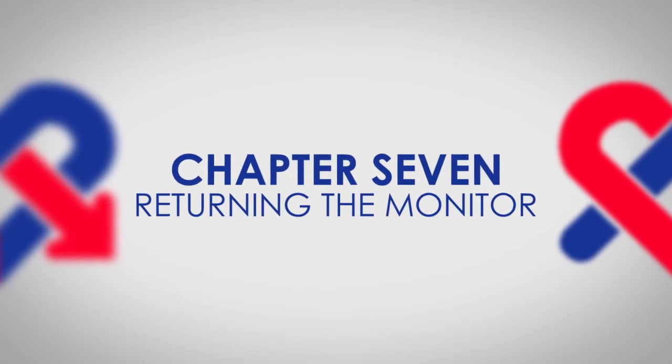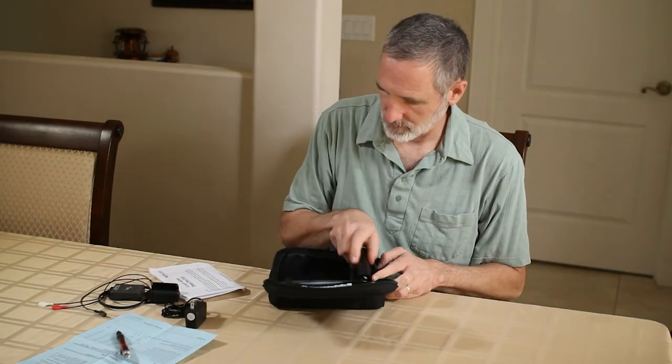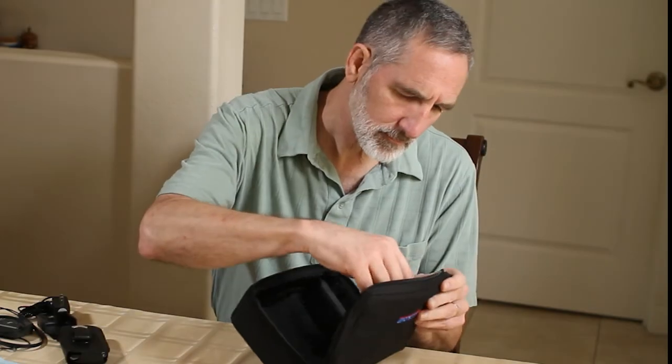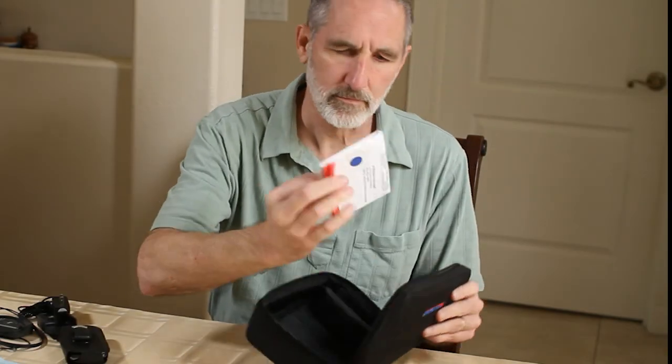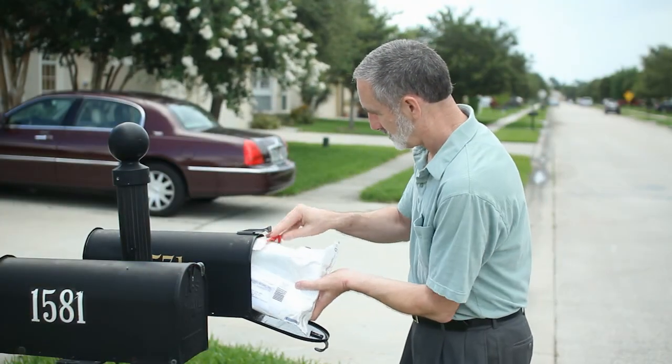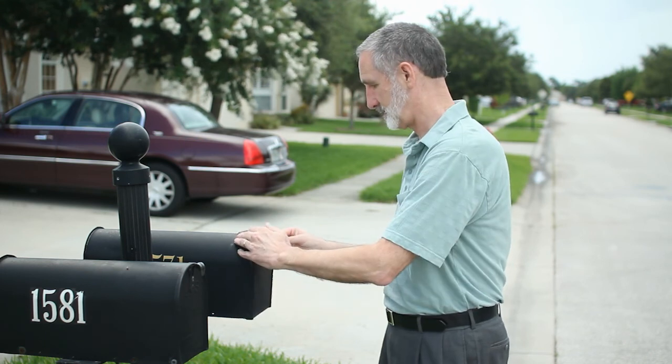Returning the monitor. Once your procedure is complete, please place all components into the monitor kit and place the kit into the prepaid return shipping envelope provided. Place the envelope in any US Postal Service mailbox or hand it to a postal carrier.